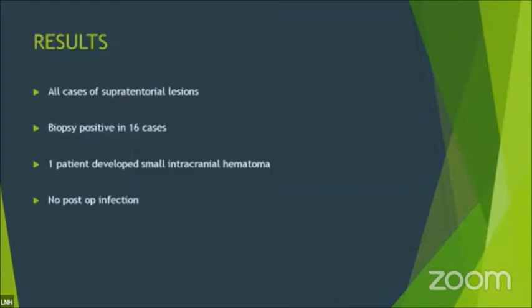So in results, we used 16 cases of supratentorial brain lesions. Biopsy was positive in all of our cases. Only one patient developed a small intracranial hematoma at the site of the lesion, but it was managed conservatively. The patient did not develop any morbidity or any deficit later on. There was no post-op infection noted.